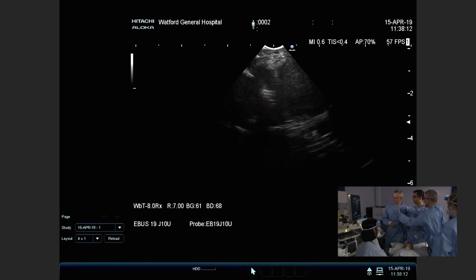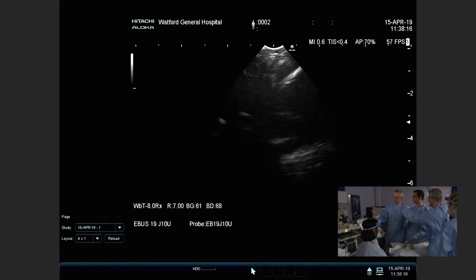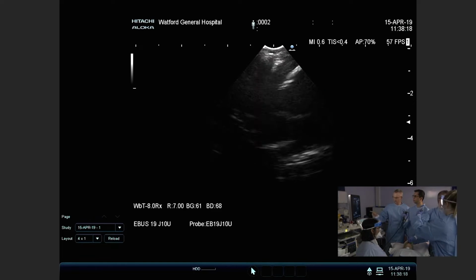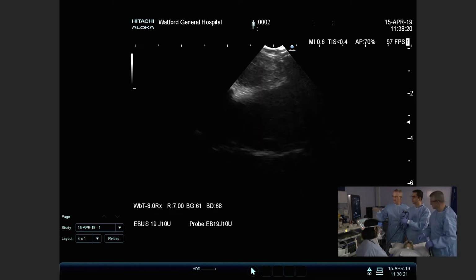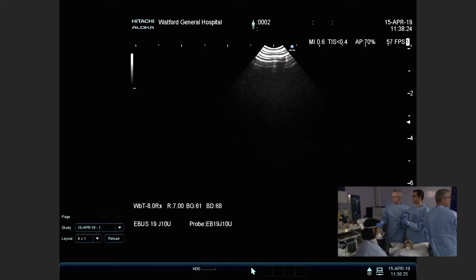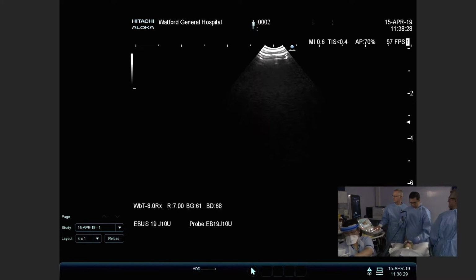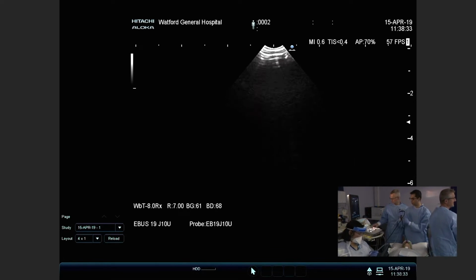So we withdraw the needle. So again, this node is 4R, right lower paratracheal, and you're sitting in the trachea. Fine. All right, so you're doing very well. I'm afraid every time the needle comes out, it does make you cough a little bit, but you're doing really well.